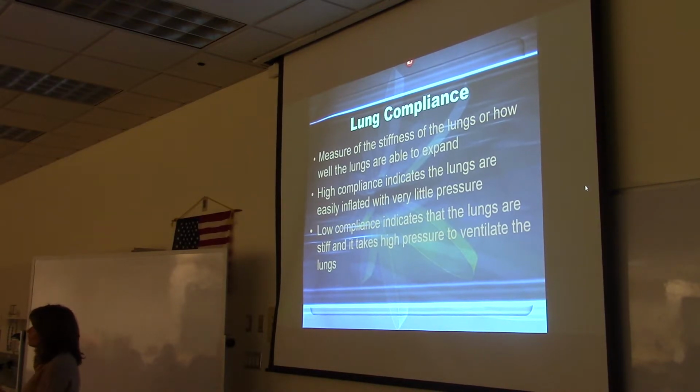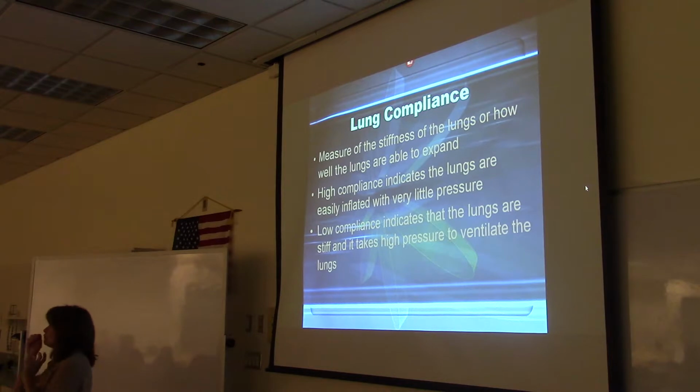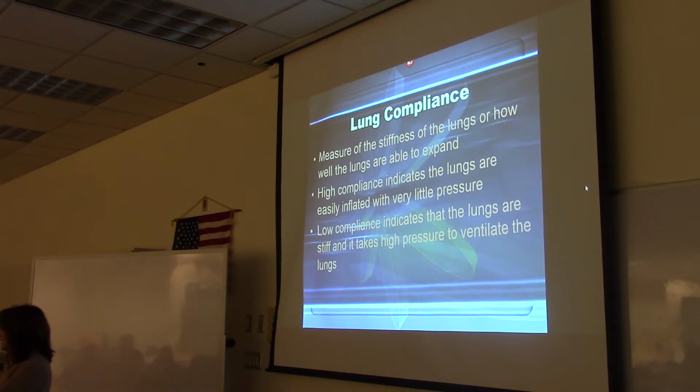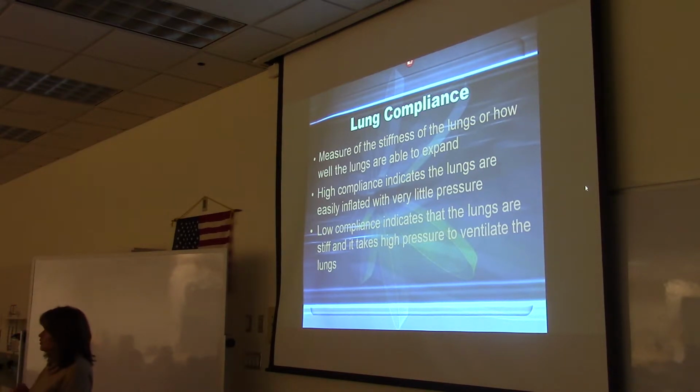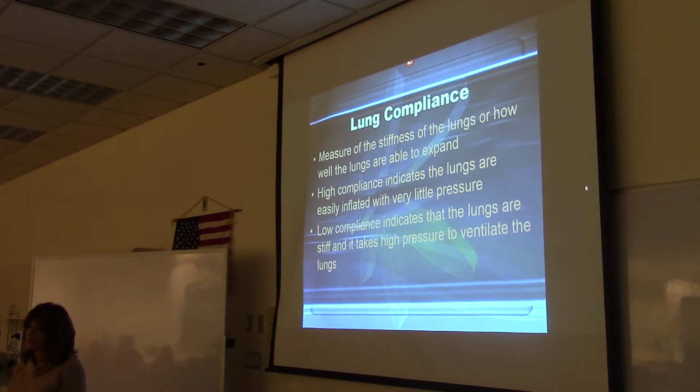All right, so when you put somebody on a ventilator and you push air into their lungs, pressure is going to build up. If they've been a smoker for many years and they have COPD, their lung tissue is really stretchy. Like if you've ever blown up a balloon 3 or 4 times, it never goes back to its original shape, it stays stretched out. Same thing with COPD lungs, they're very stretched out. Very easy to put air into those stretchy lungs.